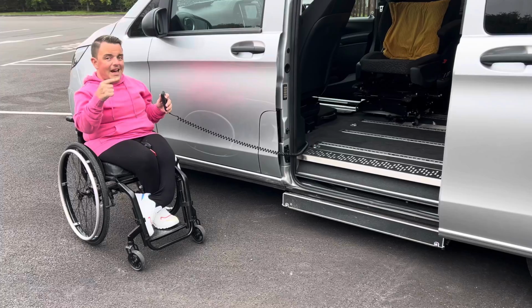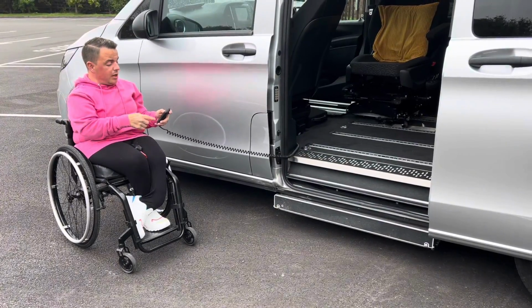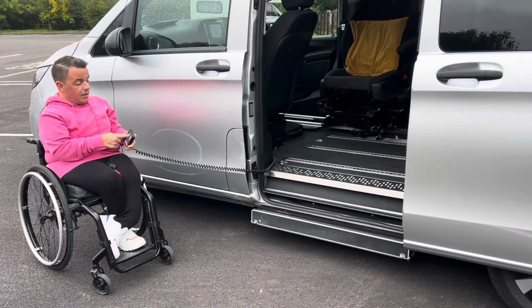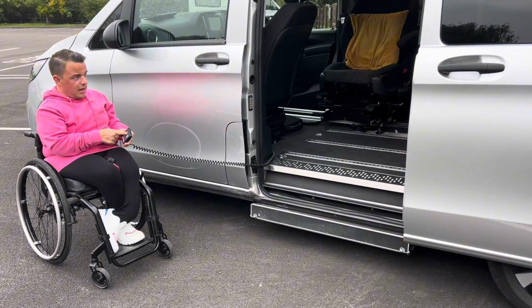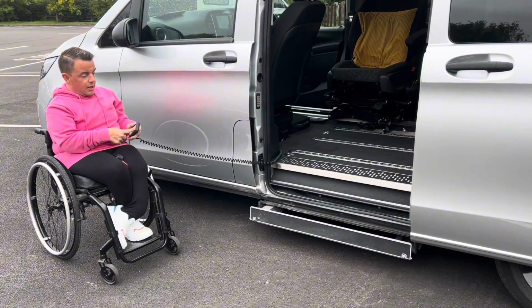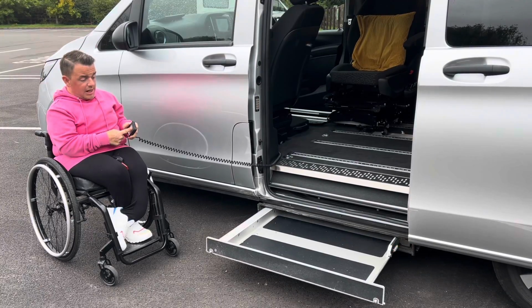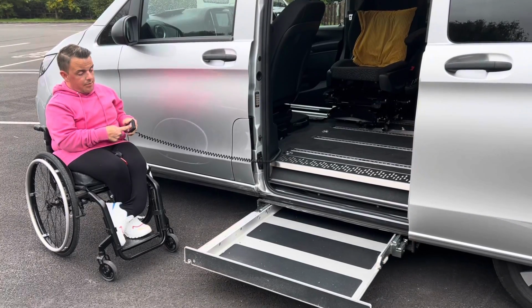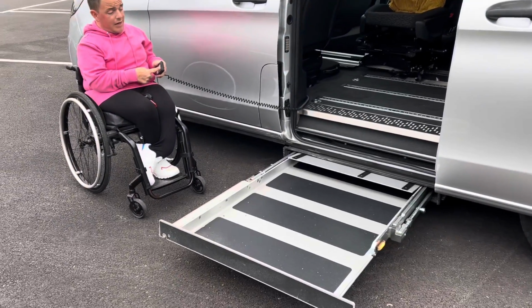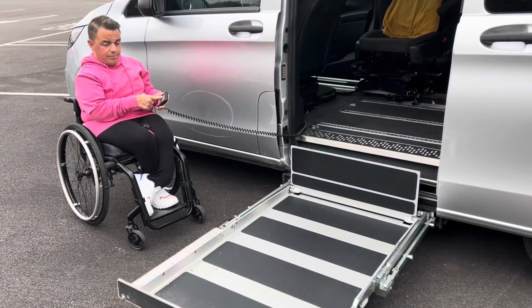So I'm going to show you the other entry, which you could have, whether you want the one on the back or this particular one. So this one is a bit annoying. I don't like this one, I'll be honest. So this one, we're going to hold that. If I press the right button, you hold out, and this again is a lift, and it comes out, and you'll see why I don't like this particular lift in a minute. So then we're going to go down.